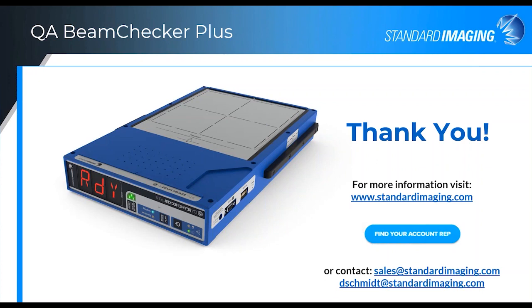If the device is off, however, and fully charged, we've taken great pains to verify that the quiescent current, the draw of the device while it's off, is not very high at all, so that the device will actually work for about, I'm going to say 3 months before the battery would be discharged, or perhaps even longer, so that when we charge these all up fully at our factory when we ship them, with the idea that when they get to you, the battery should not be dead. So that is the goal.